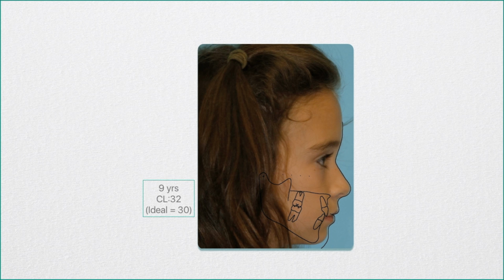This patient has the Bolton norm superimposed over the face, showing how well the face adapts to the Bolton norm. We're going to deal with that in another segment with the Bolton norm.